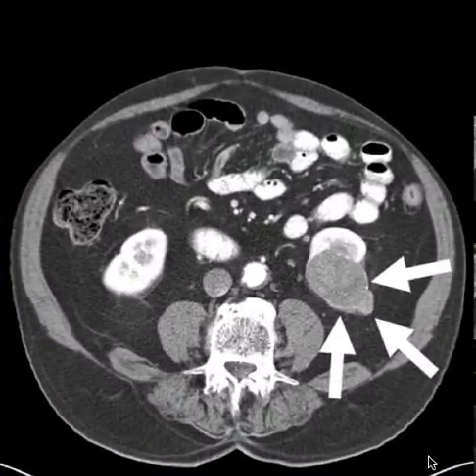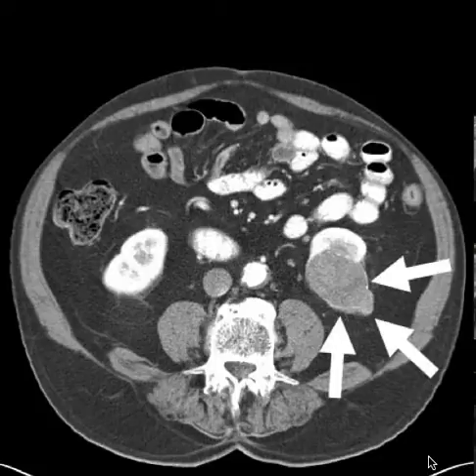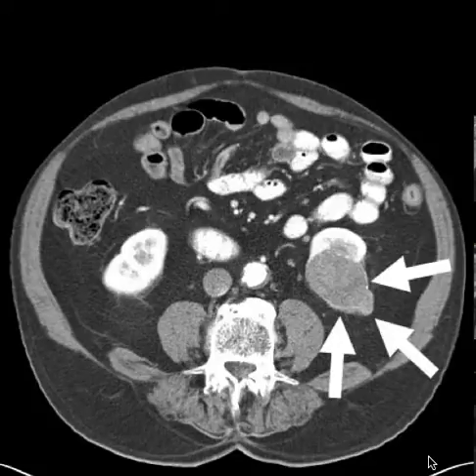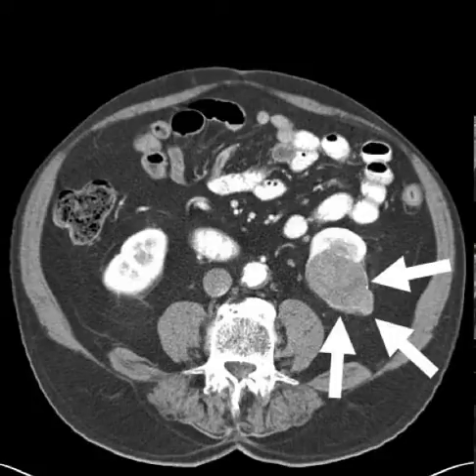Moving on, so we have another example. In this case, it is going to be a renal cell carcinoma. And going back to the enhancement, we define enhancement as more than 15 Hounsfield units, an absolute increase of 15. So we're going to compare our pre-contrast examination with our post-contrast examination and measure in Hounsfield units that difference. And that difference is going to make us suspicious that this is a vascular tumor, and RCC is known to be a very vascular tumor.